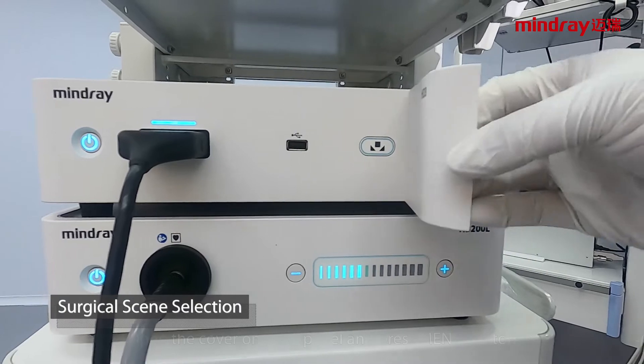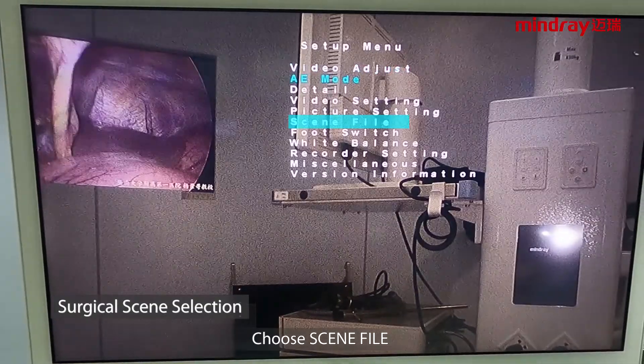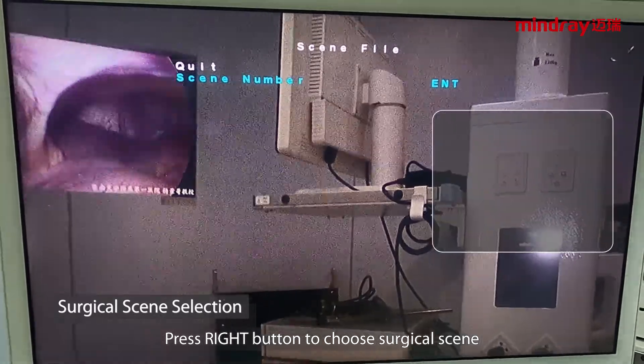Surgical scene selection: open the cover on the front panel and press the menu button. Choose the scene file and press OK. Choose the scene number, then press the right button to choose the surgical scene.